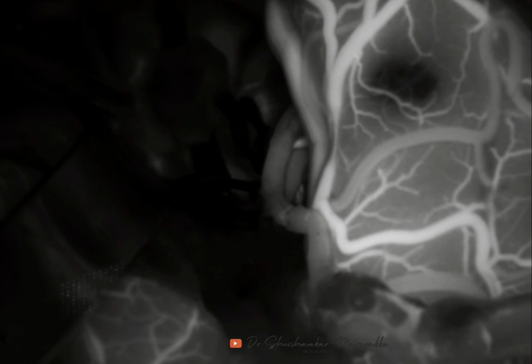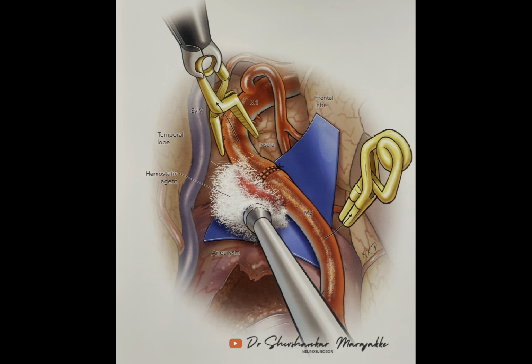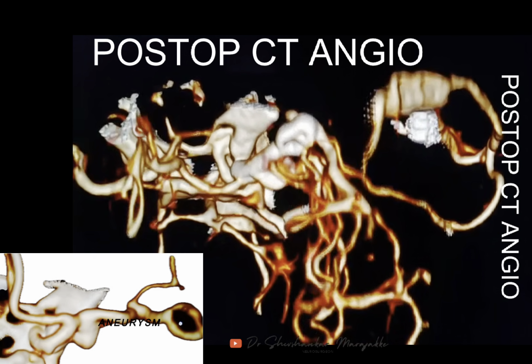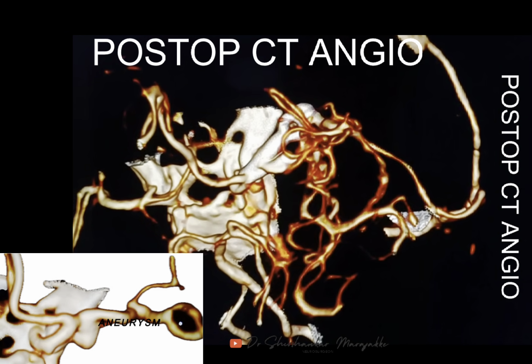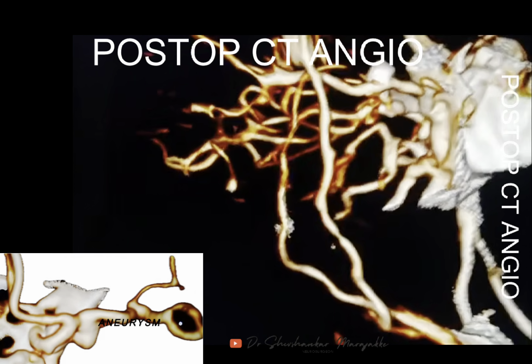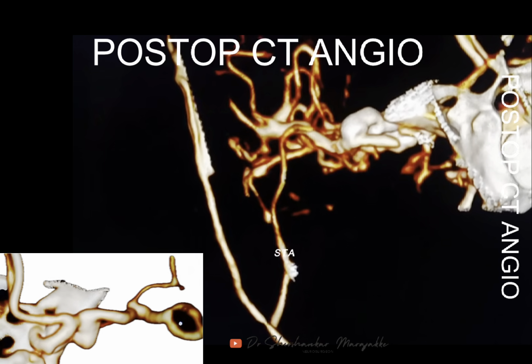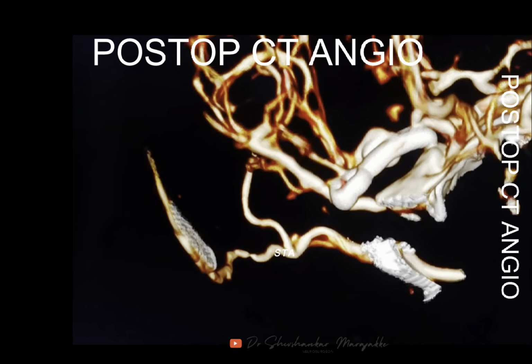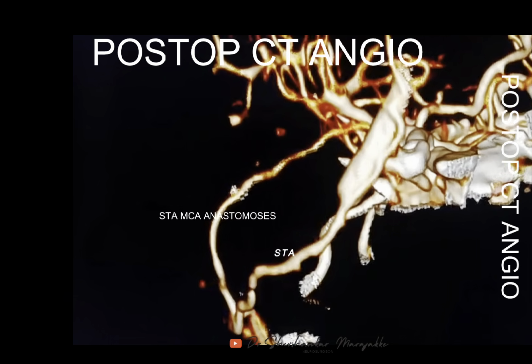So this is quite important for any surgeon to learn and be prepared for any vascular events in any cases of trauma or any surgeries like skull-base meningiomas and even CP angle surgeries or CVJ. Sometimes we might injure complex CVJs, we might injure the vertebral artery. So in this you can see that the anterior temporal artery and ST are quietly filling, that is the anastomotic site.